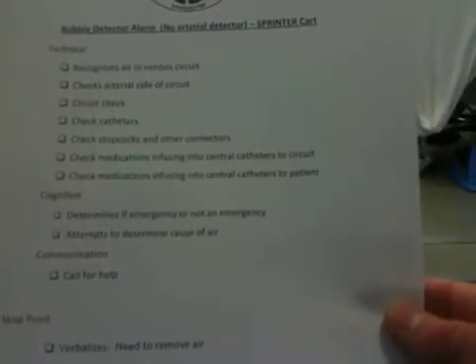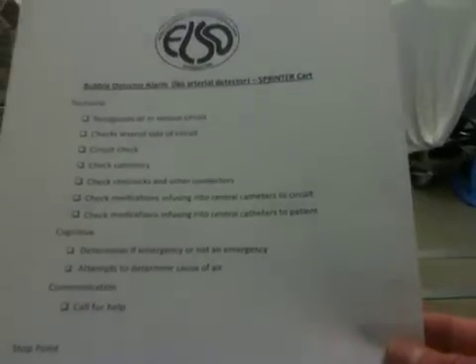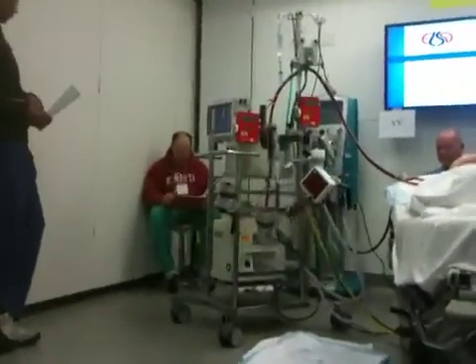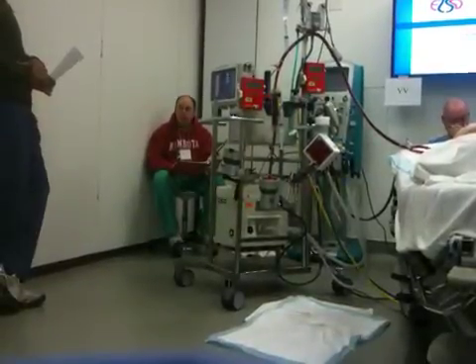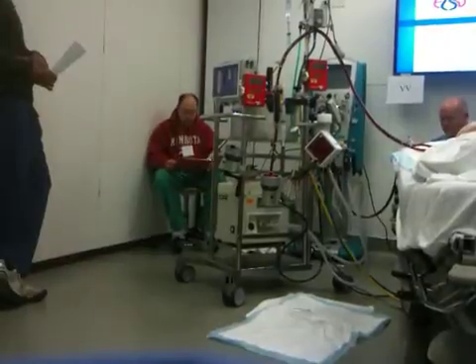So for the arterial air, you're going to recognize that the pump's off because it should be alarming. It should alarm. You need to look at the front or the display to figure out why it's alarming and what stopped the pump. Recognize that it was the arterial bubble detector alarm. Clamp the patient off ECMO because you have air on the arterial side of the circuit. Do a complete circuit check.